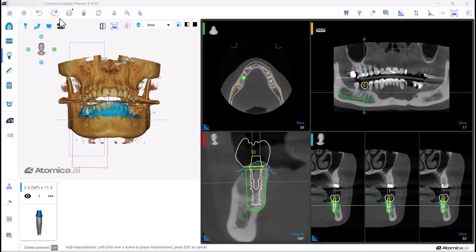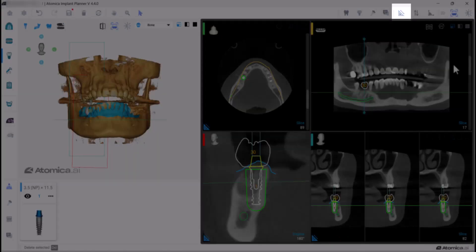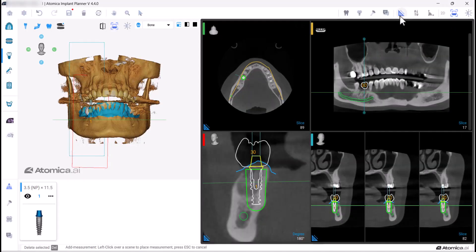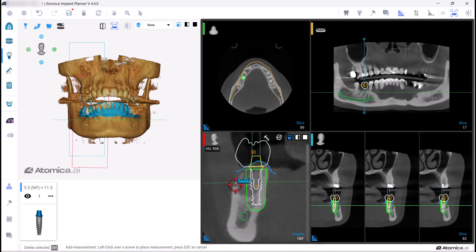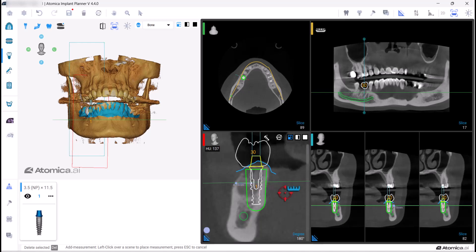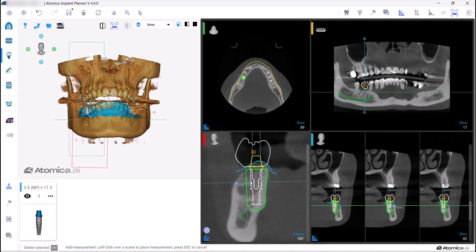Except the panoramic view, using the Add Measurement tool. Click on the measurement button — the cursor will change to a ruler with a cross shape. Click the first point to start measuring, then click the second point to calculate the measurement.